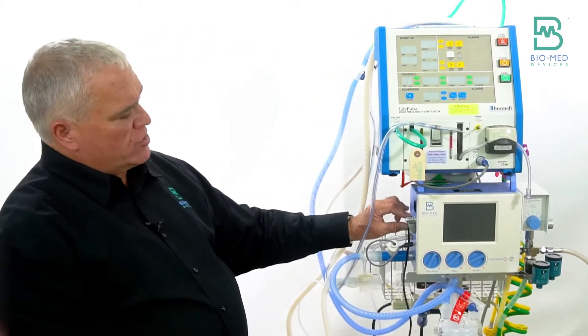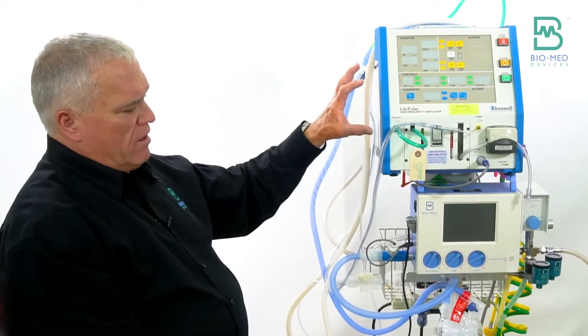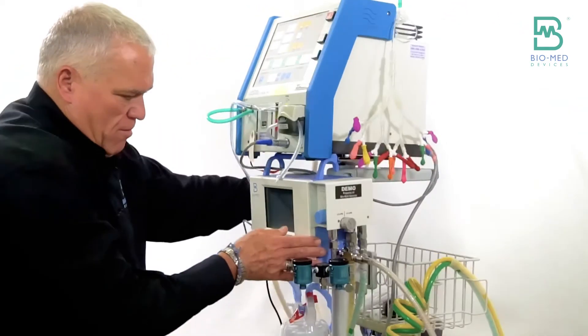We're not using the flow sensor when we use it with the jet. So we're going to use the vent in constant flow mode.